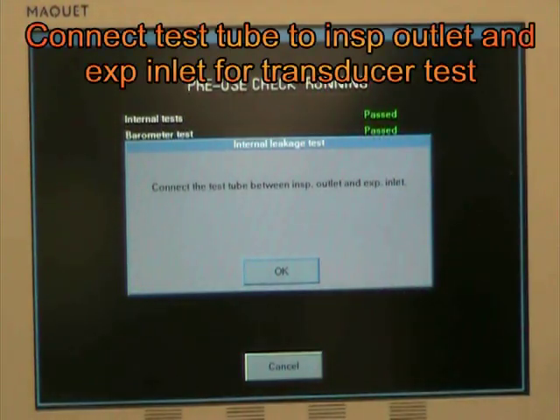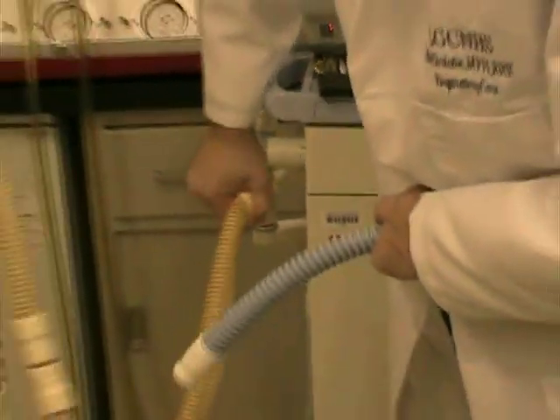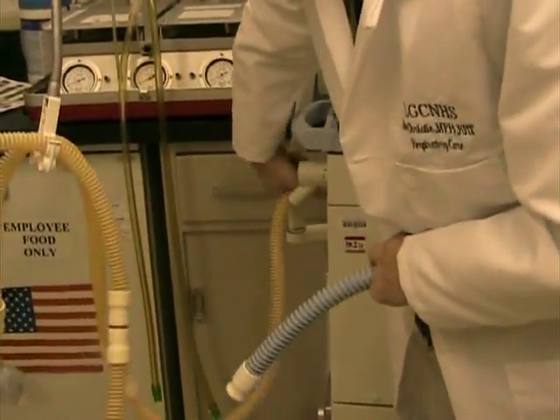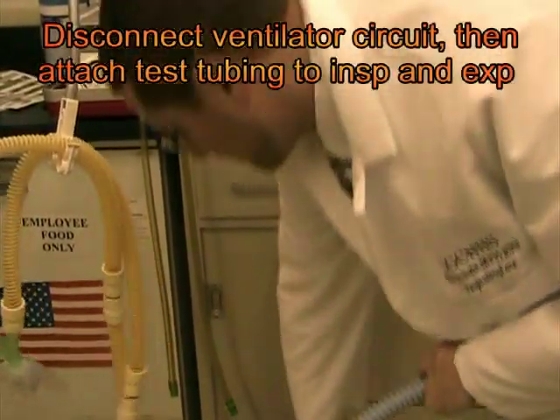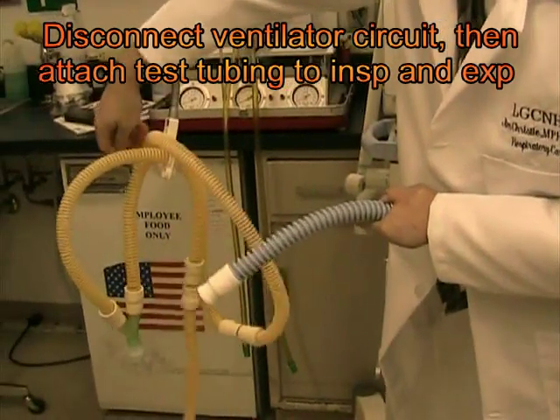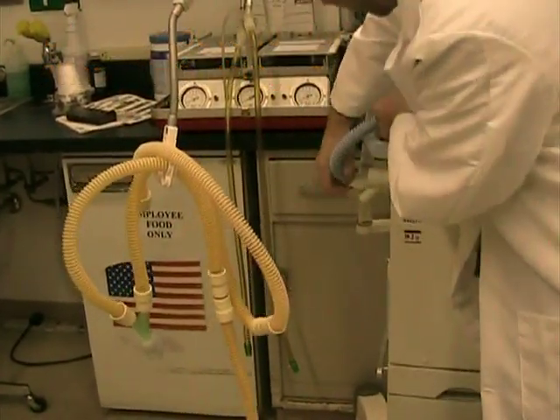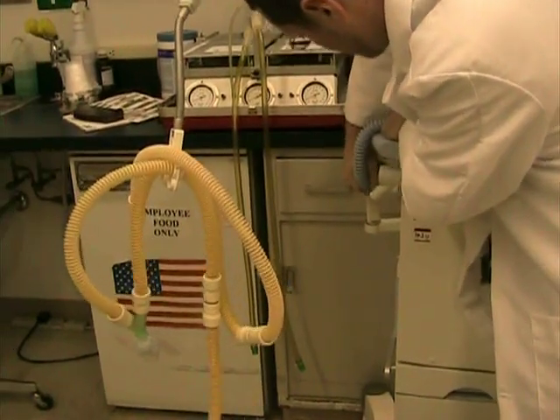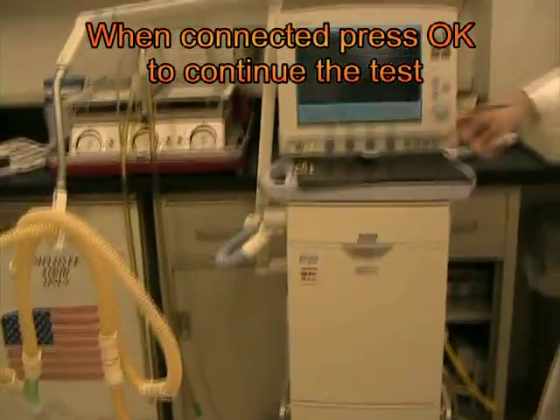The machine asks you to connect the test tubing between the inspiratory outlet and the expiratory outlet. The tubing is located in the bottom drawer of the ventilator. Take off the circuit — be sure not to drop it on the floor — and connect the test tubing between the two outlets. After that, hit OK to continue the test.